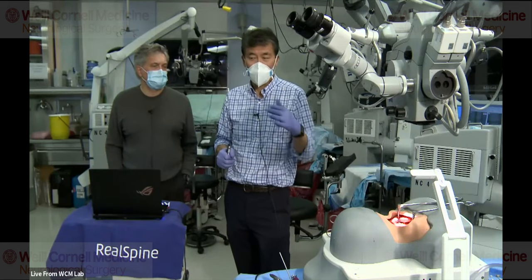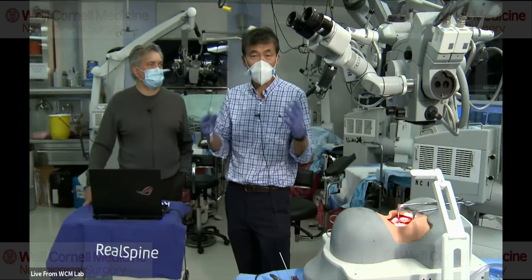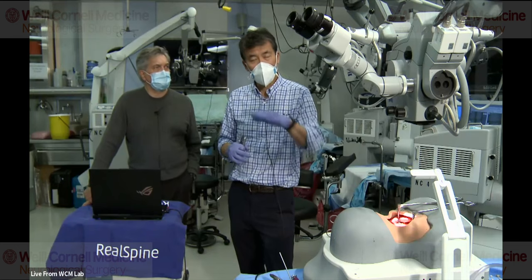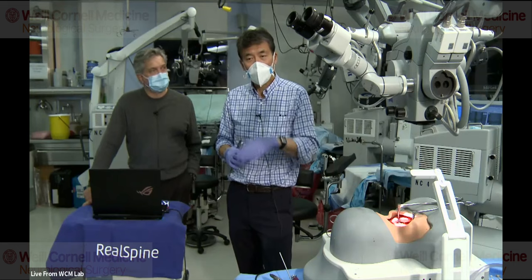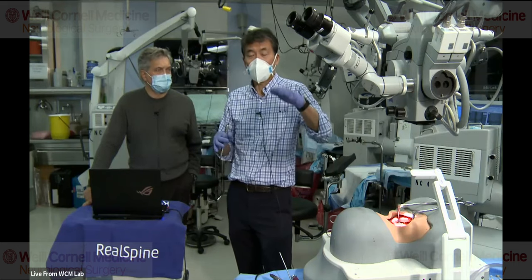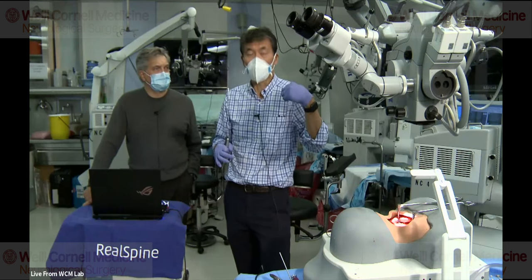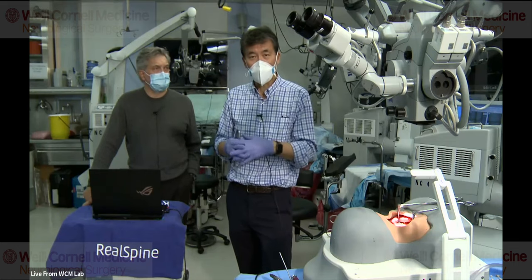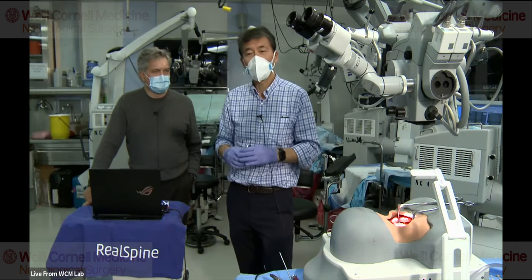at C6-7 because you need something behind C7, I have done C7 laminoplasties, and I have gotten away with it, but I'm always scared if I have to do that. And if you can just undercut it and do a dome laminoplasty of C7, undercutting it, you're better off. If you take too much of C7 and go up into the spinous process, you can actually cause a stress riser where the patient goes like this and they fracture that spinous process off. That's happened to me a couple of times. So if you're doing a dome laminoplasty, stay kind of low.